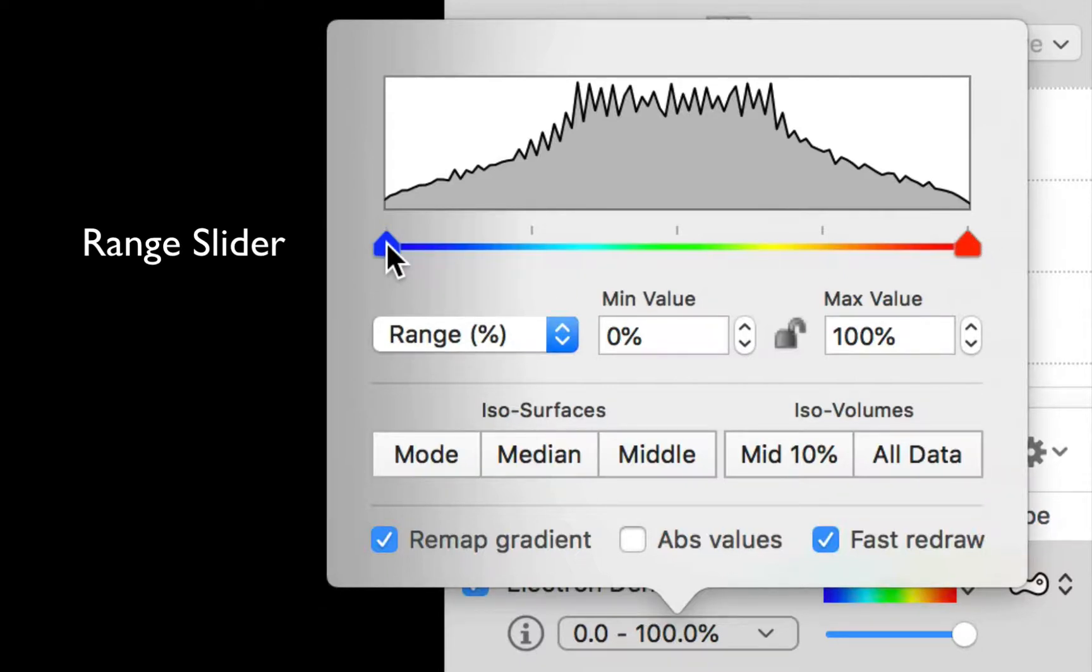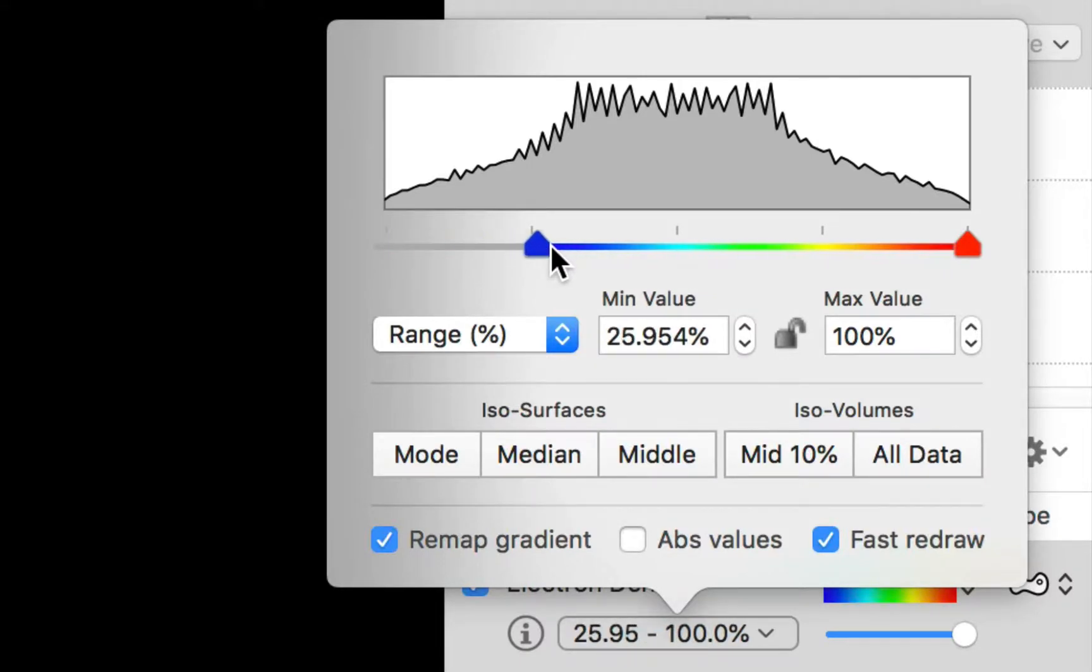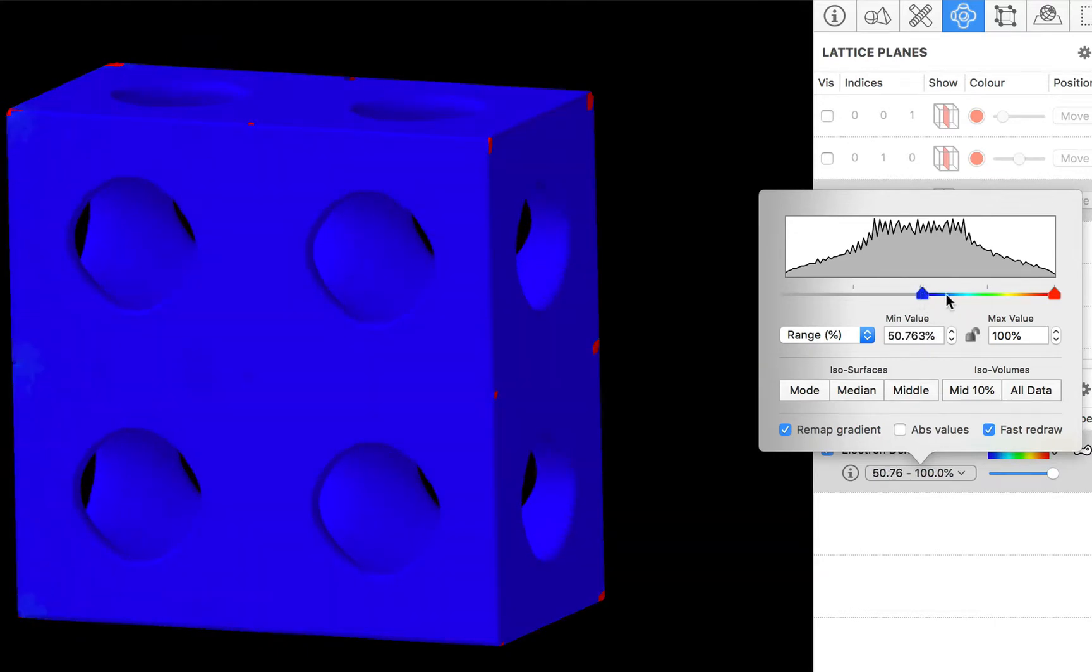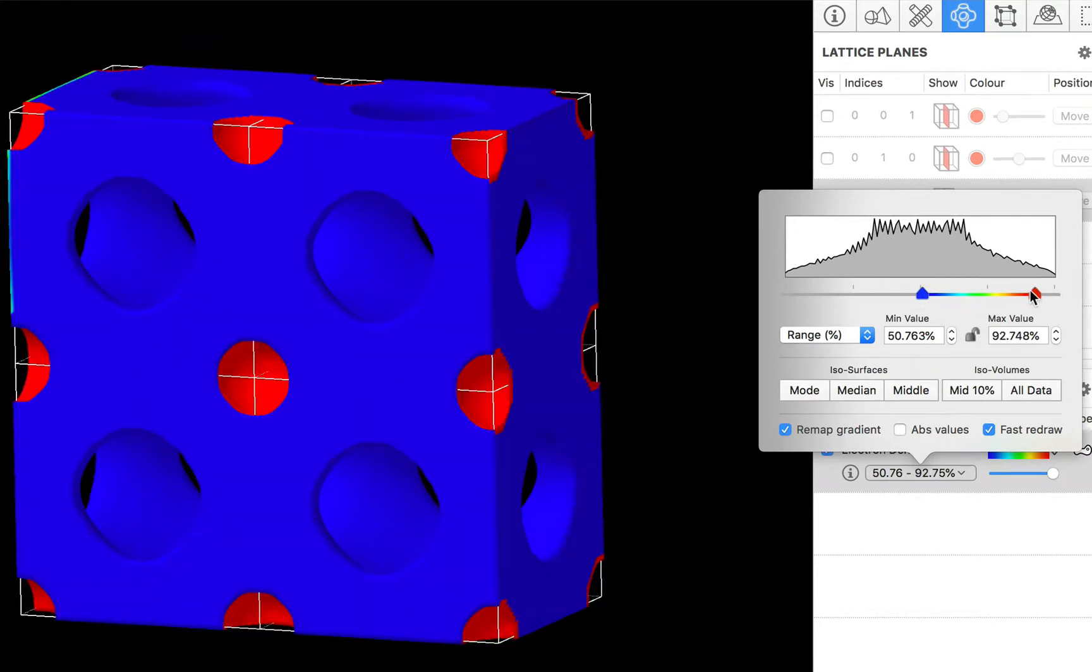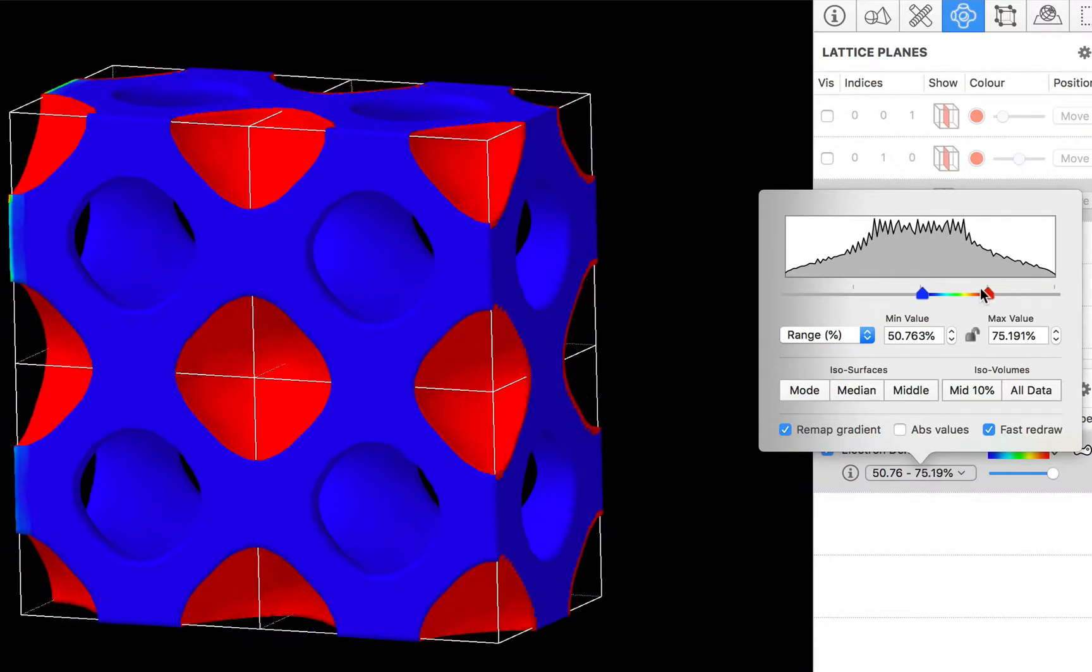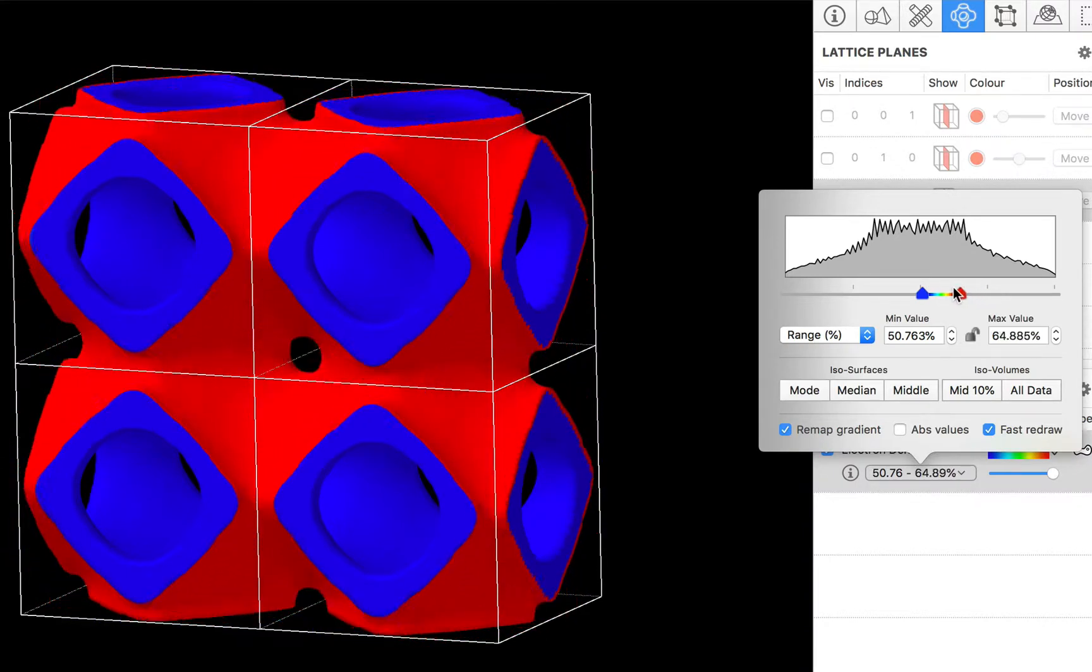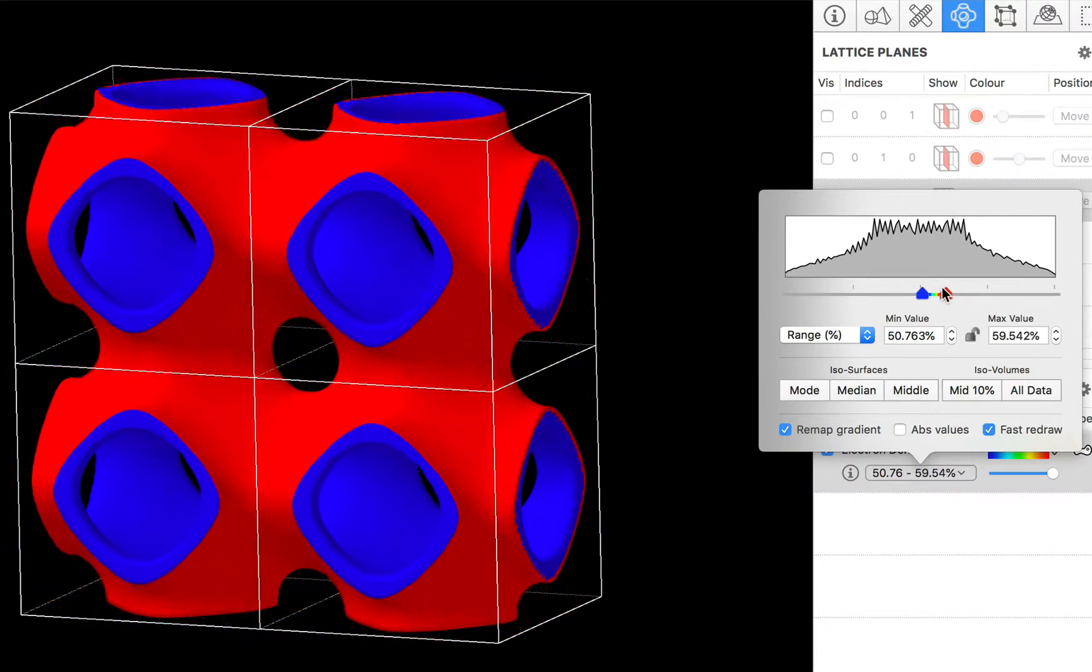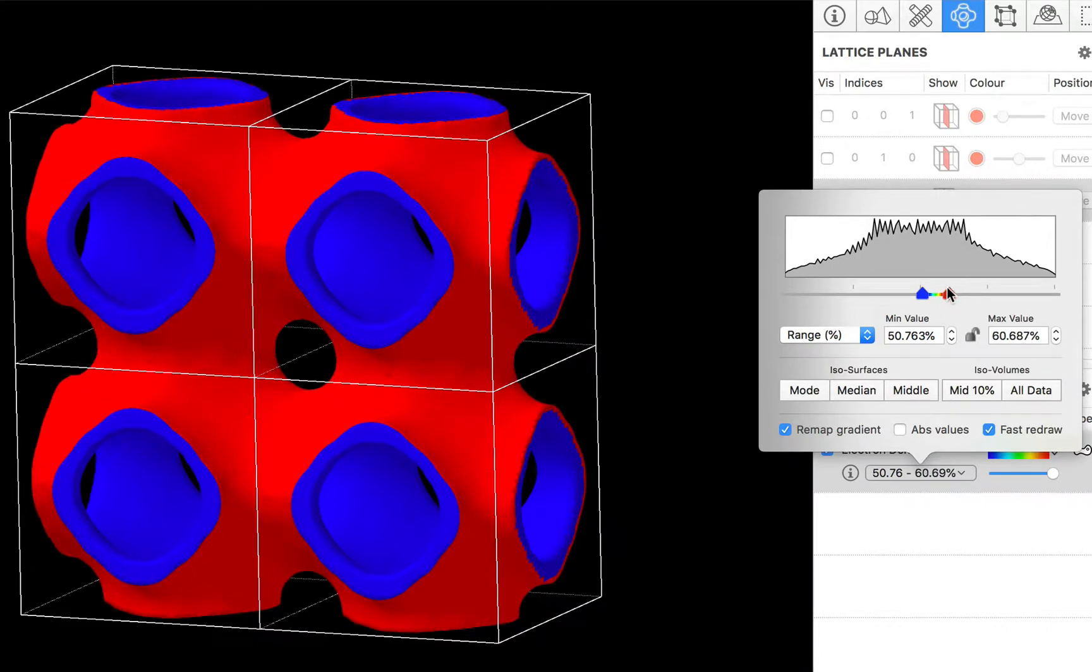And we can click and drag these thumbs to adjust the range of values that are displayed. So if I want to look at part of my data set, I can narrow in the data range just by clicking and dragging with the thumbs.